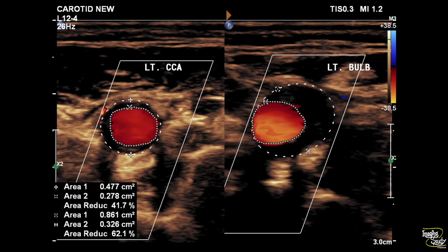Here's the left common carotid artery showing mild surface area reduction. Here's the left carotid bulb with a substantially sonolucent plaque causing more than 60% surface area reduction, indicating moderate luminal stenosis.